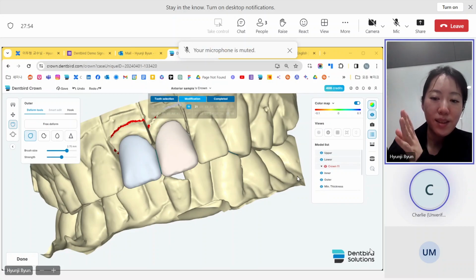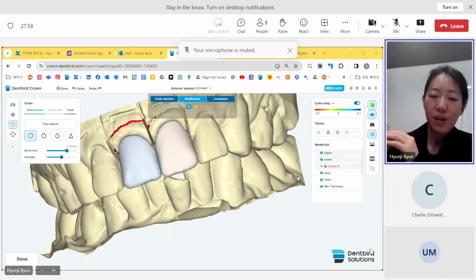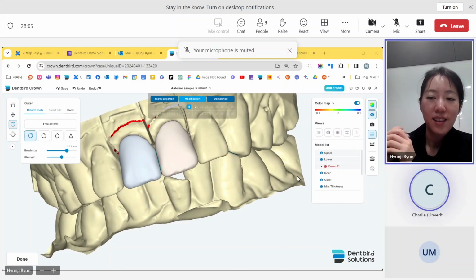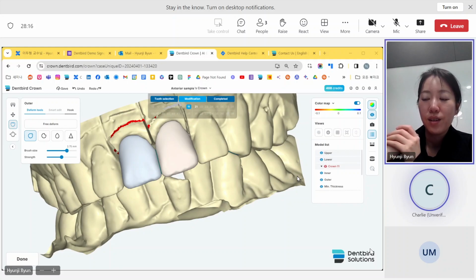I hope you get some help from another person who has done this. We will have a few dentists work with us on this project. For the trial, we want to test on a few patients ourselves.